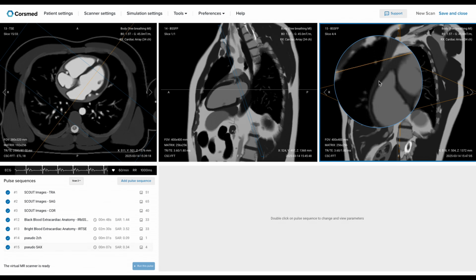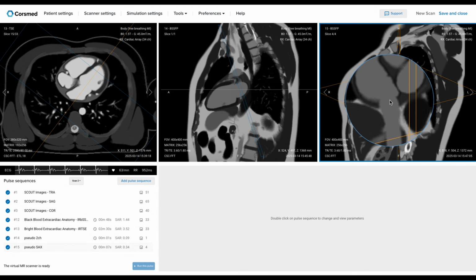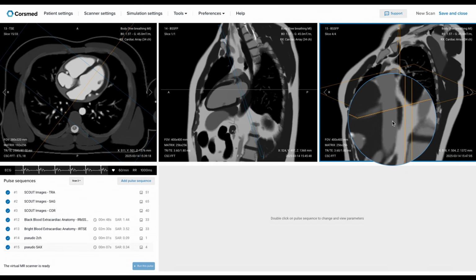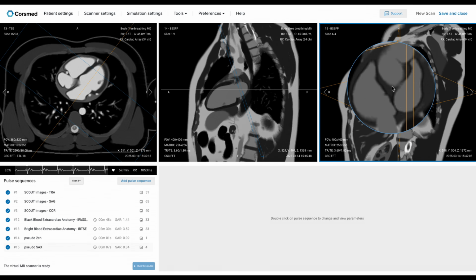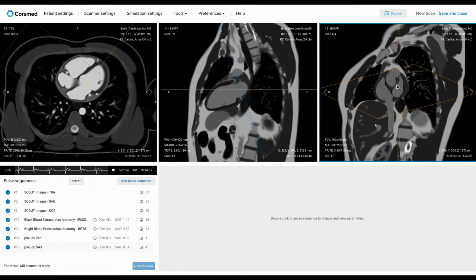And finally, we have the right atrium over here. You can also see the inferior vena cava entering this chamber. This image is the most important one in the series. If you're unsure when or how to take the short axis images, it's best to start with a few extra slices. Usually, taking 3 or 4 slices is enough to make sure you're covered.